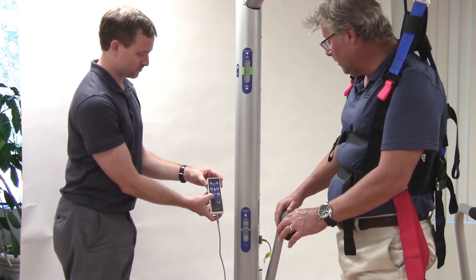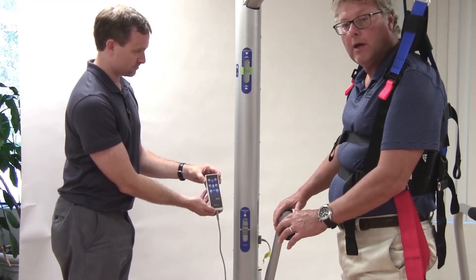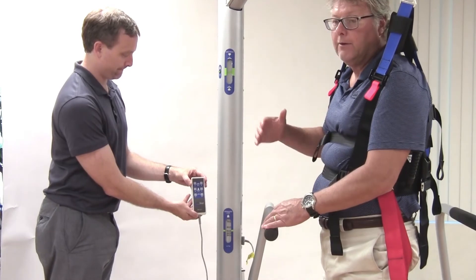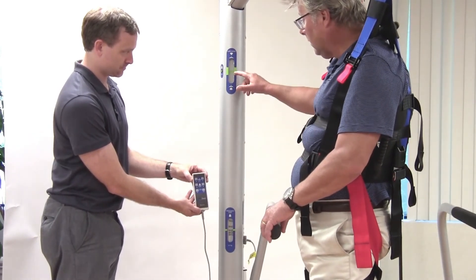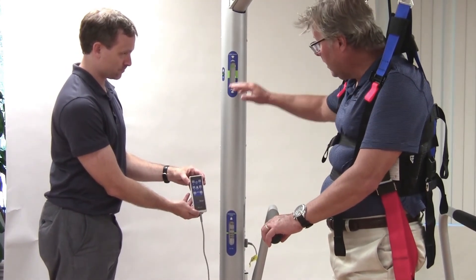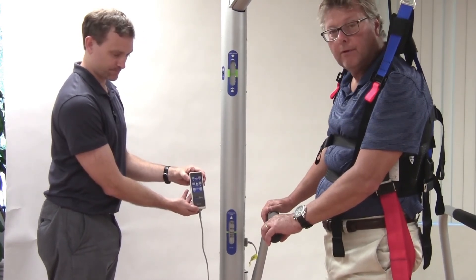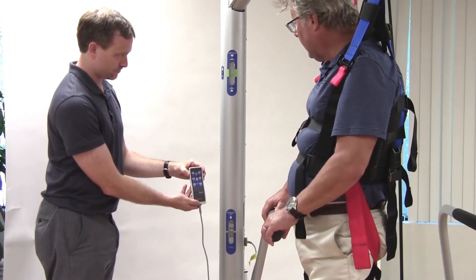When Dave picks the auto unload and that green light is on, it means it's going to automatically compensate. I'm going to stand on my tippy toes, which naturally will take some load off me. You'll see the bar automatically move in. If I move down to get my full load on it, the bar is up high, so Dave has to manually lower the bar to get back in range, then put the auto on and it moves back in.